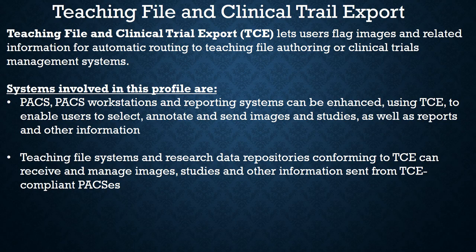Teaching File and Clinical Trial Export, TCE, lets users flag images and related information for automatic routing to teaching file, authoring, or clinical trials management systems.